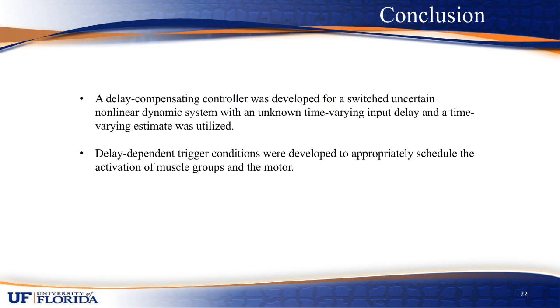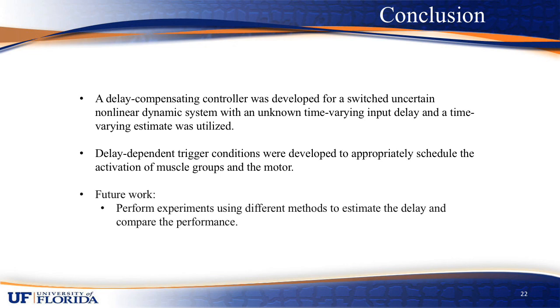In conclusion, a delay compensating controller was developed for a switched, uncertain nonlinear dynamic system with an unknown time-varying input delay, and a time-varying estimate was utilized. Delay-dependent trigger conditions were developed to appropriately schedule the activation of muscle groups and the motor. For future work, experiments will be performed using different methods to estimate the delay and to compare the performance.